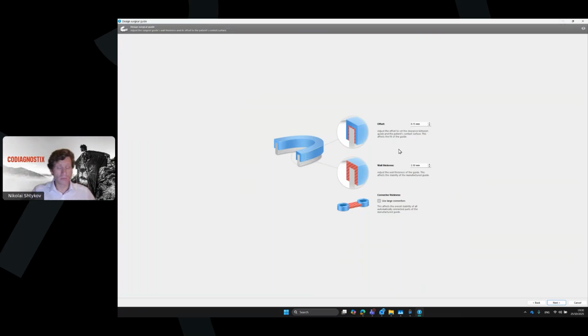And mostly when I am working with a calibrated good printer with the 3D objects as I designed, and I don't have a scan of the object, I have a 3D model of the object, and I put it virtually before. So in these cases, I use a small offset.